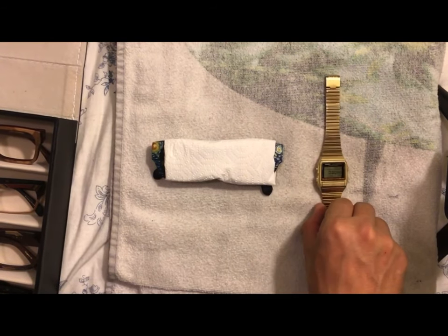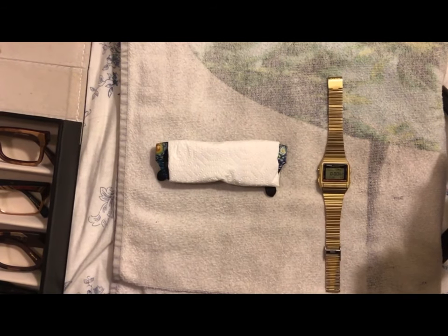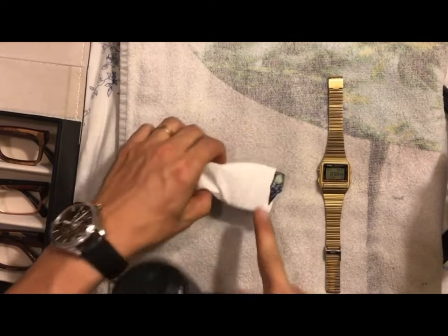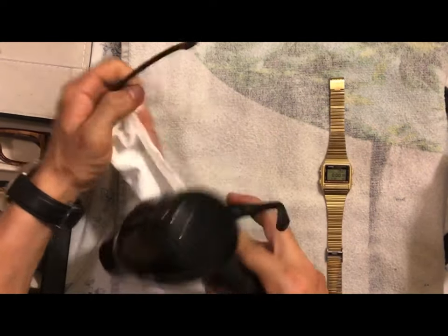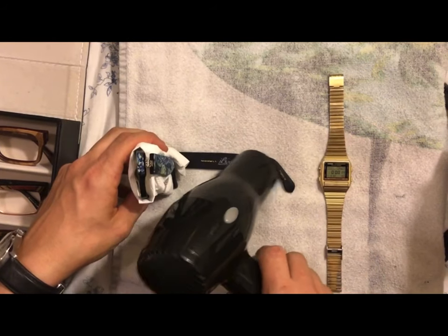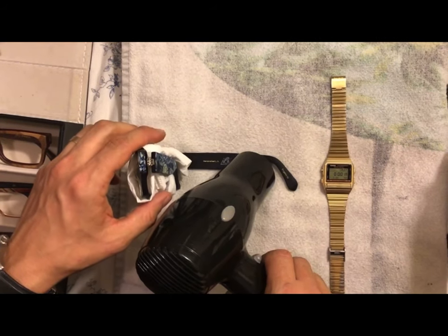Hey guys, thank you so much for joining me. I'm going to show you how to adjust a pair of glasses. I've got my frame sitting on a towel, wrapped in a small paper cloth so that I'm protecting the lenses from too much heat.